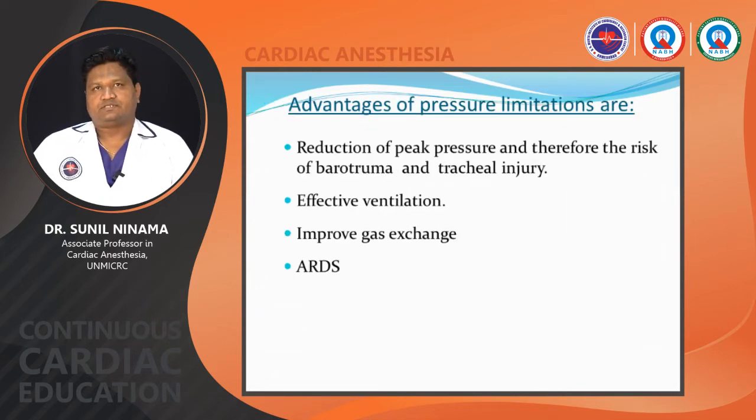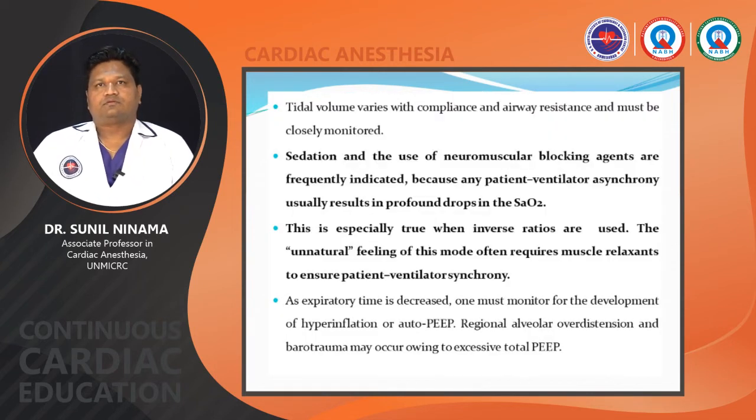Advantages of pressure limitation are reduced peak pressures, therefore the risk of barotrauma and tracheal injuries is very low. Effective ventilation improves gas exchange, and it is used in the case of ARDS. So when a patient is developing ARDS, you have to keep this patient on pressure control ventilation.